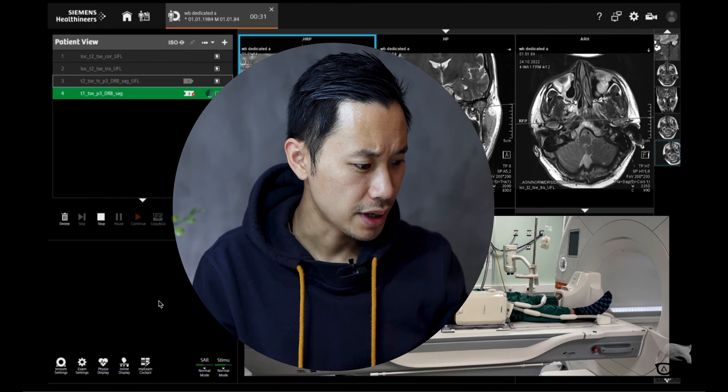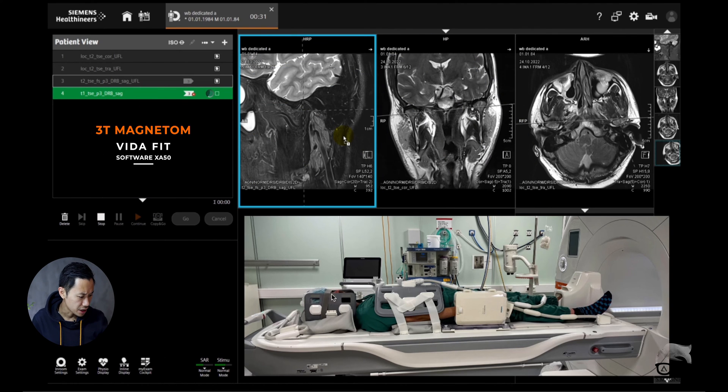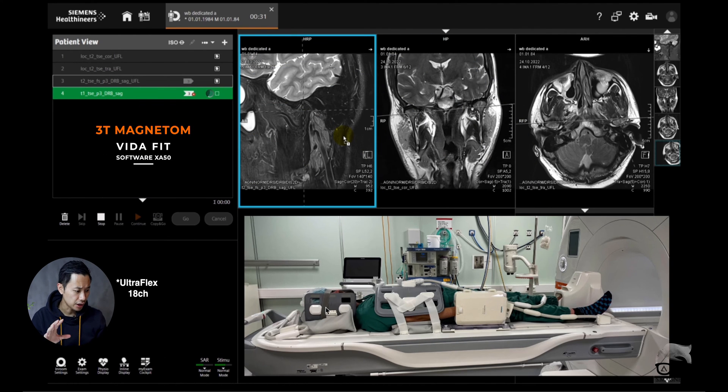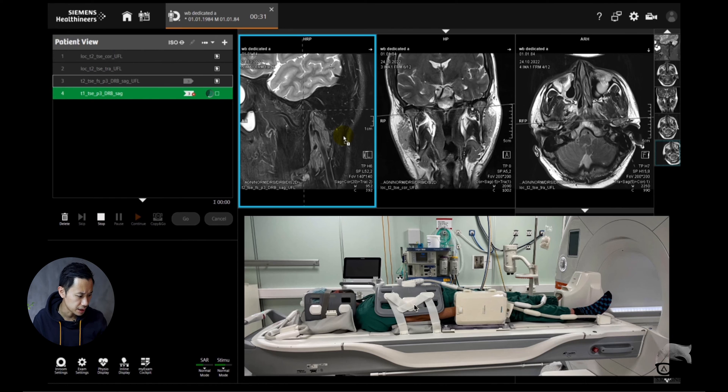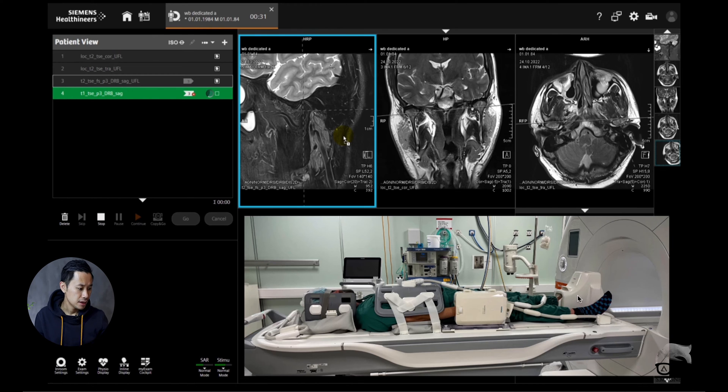As you can see here we have TMJ covered with the Ultraflex 16 channel, the large one. Then we have the body 18 matrix, the spine in back there, the hand wrist covered, and we also have the ankle covered.